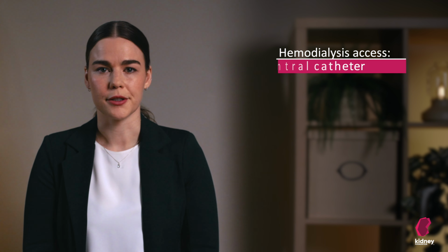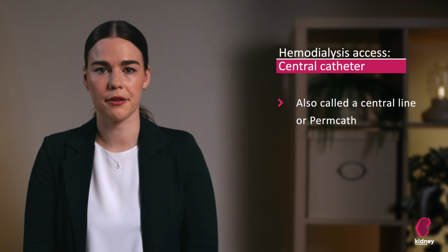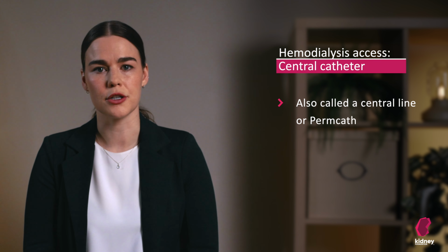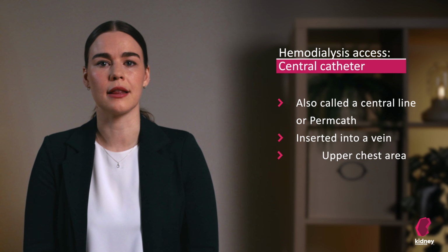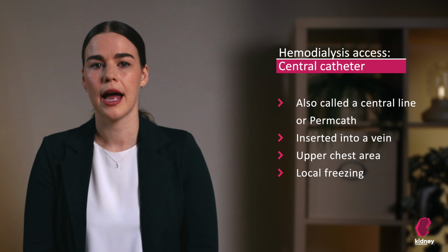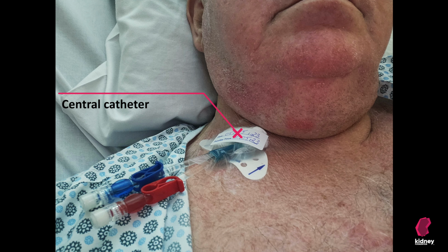The central catheter. The central catheter is also called a central line or a perm cath. It is a small plastic tube, like an intravenous line, that is inserted into a vein in the upper chest area. It is inserted using local freezing, and you don't need to be put to sleep. Here's a picture of a central catheter. The catheter is always covered by a dressing, often a transparent one, like in this picture.